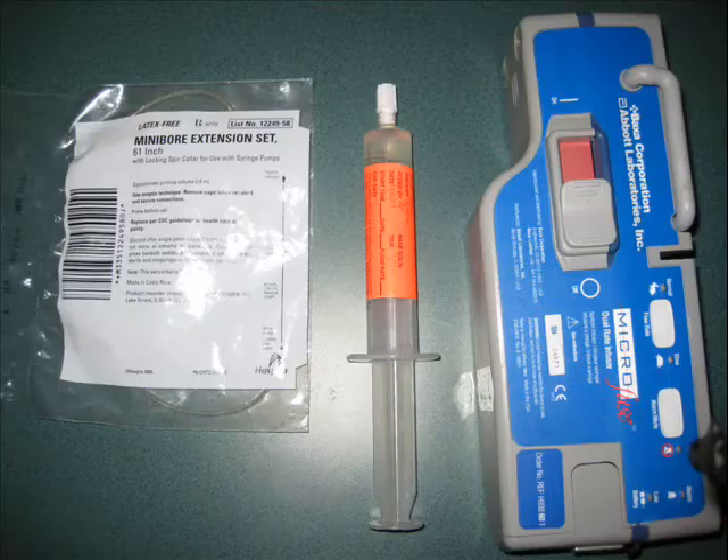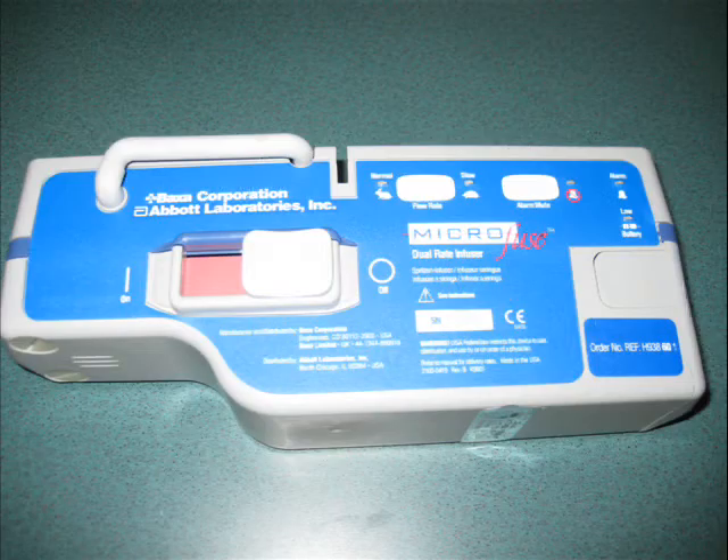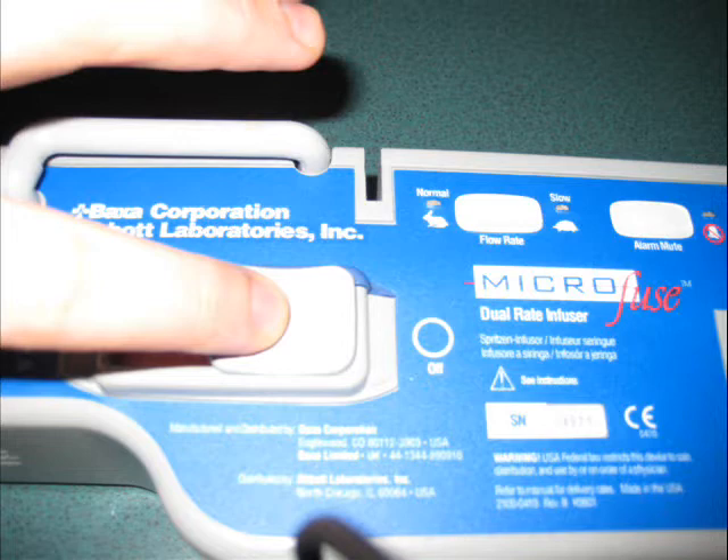This is the explanation of the syringe pump and how to work with one. For working with a syringe pump, you need your equipment and of course the syringe pump itself: your medication, microbore tubing, and the pump.